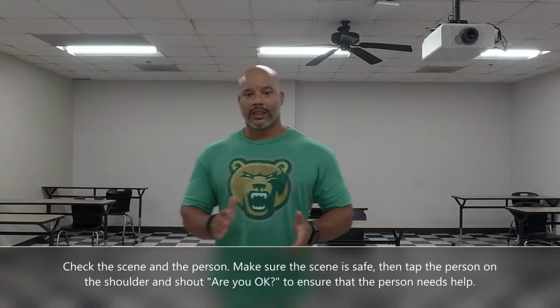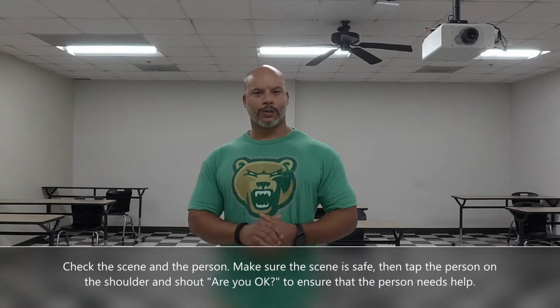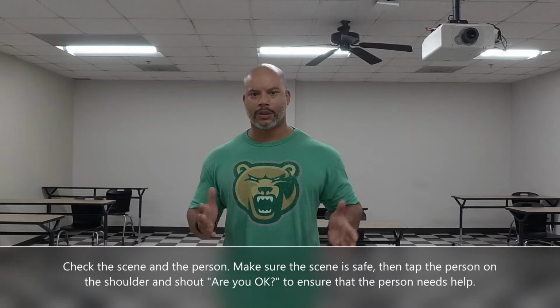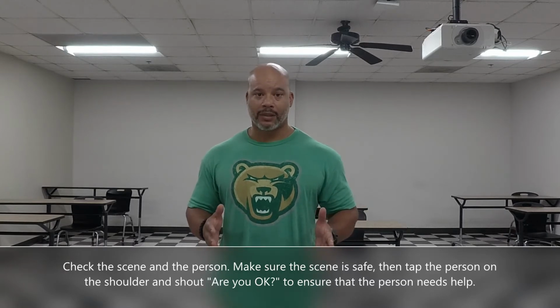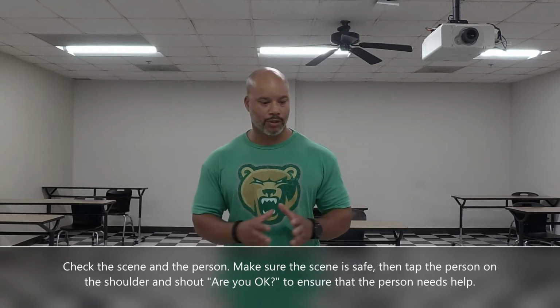We're ready to get started, but there are two things we need to do real quick. I know everybody's ready to get started with those compressions and that AED. They want to see what that thing can do, but we have to talk about these two. First thing being safety. You have to make sure the scene is safe. You get there, make sure everything is all right.